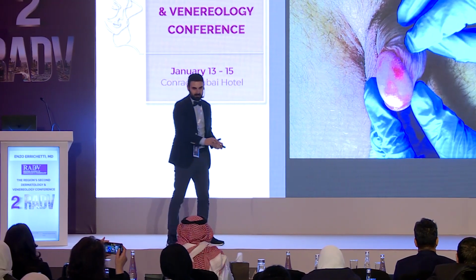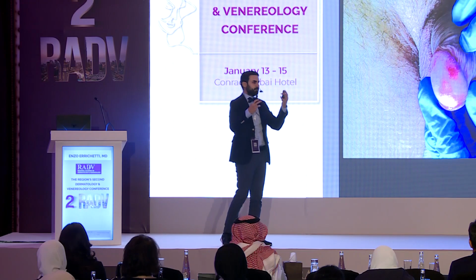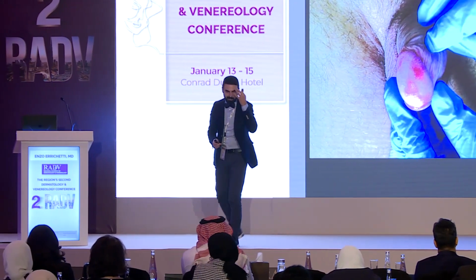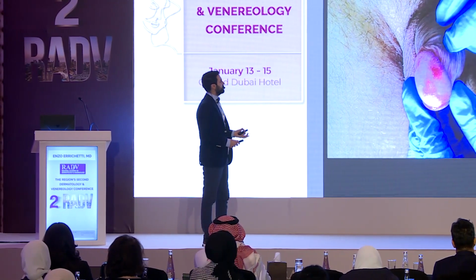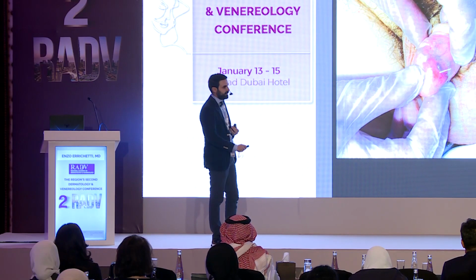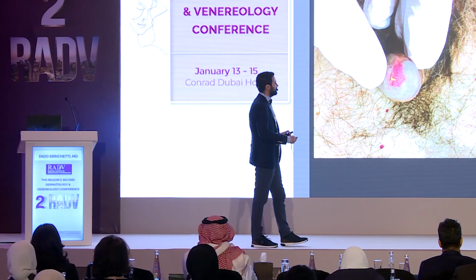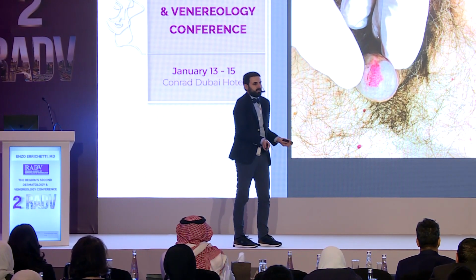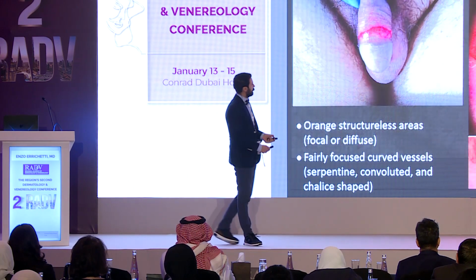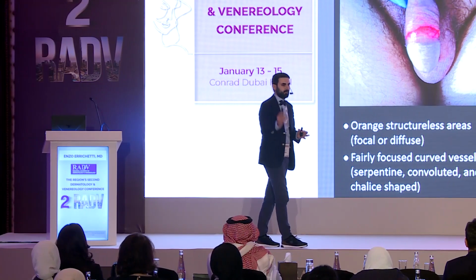They may look very similar. Okay, these cases are pretty similar. Of course, we can have an idea, okay? I don't know if you have the diagnosis in mind, but it's pretty challenging. Even these 2 cases, to me, look very, very similar. But we will come back. Even these cases, you know, they are quite unspecific. We cannot do the diagnosis only by clinical examination. But let's take a look at the dermoscopic clues of chronic balanitis and erythroplasia.